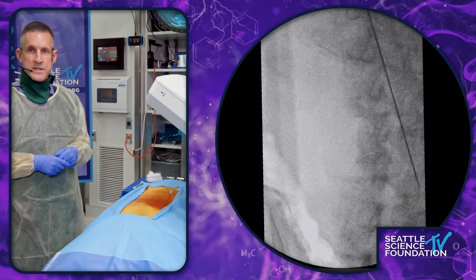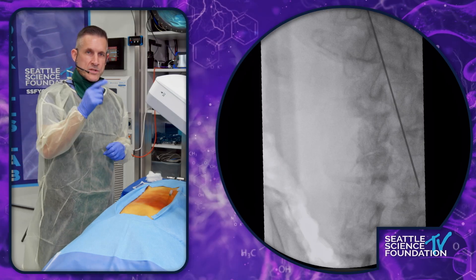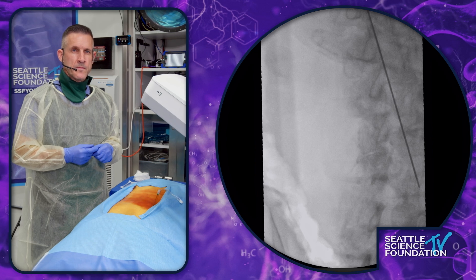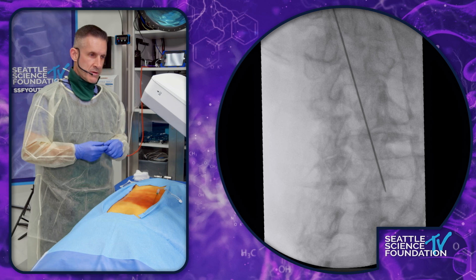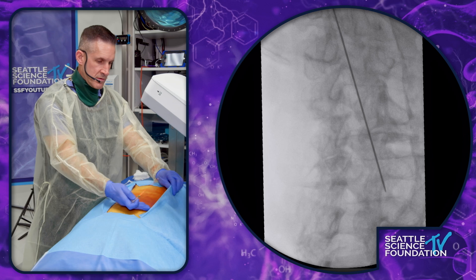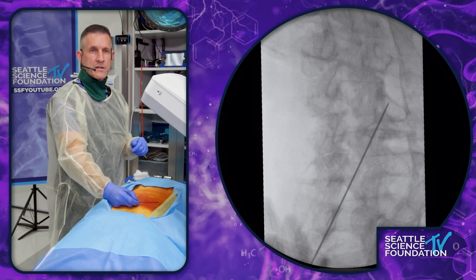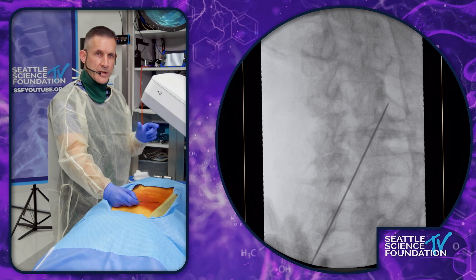You always want to start out with something you can see. We're going to look for an oblique image. I'm going to just place one of these needles here, give myself a little bit more working room. So right there you'll see basically that if I go right down — I always say I'm going to try to put this on the eye of the Scotty dog, and we all know the Scotty dog.